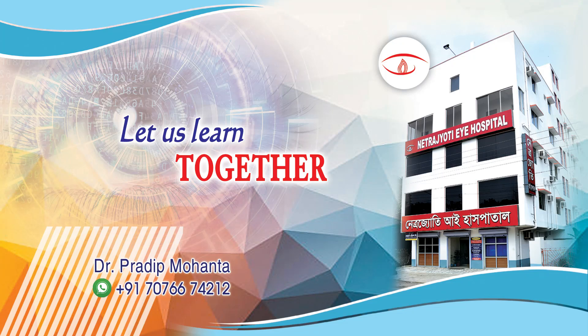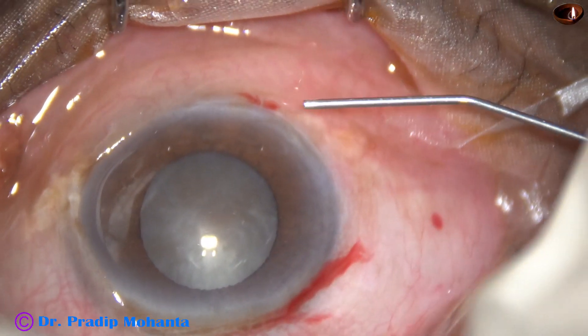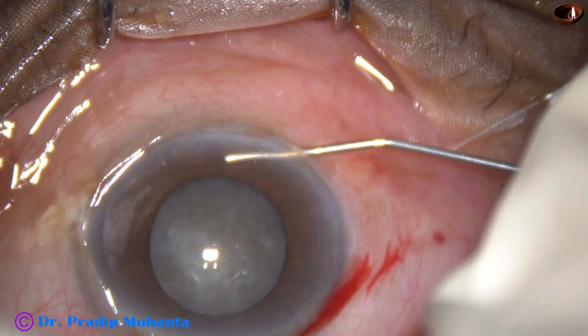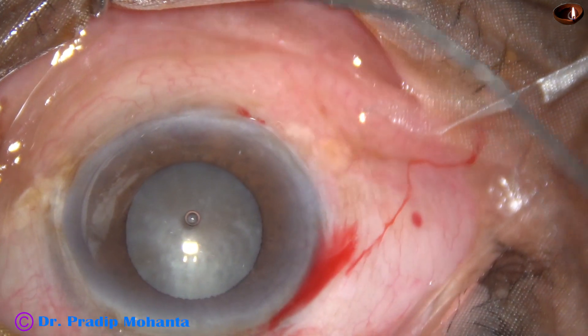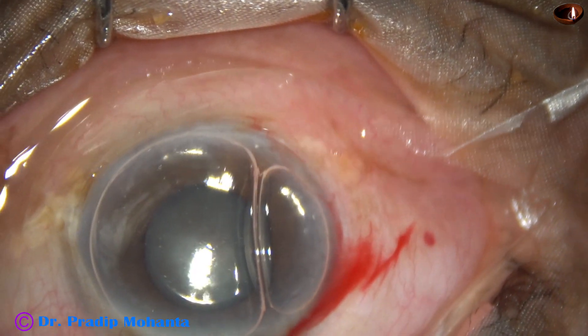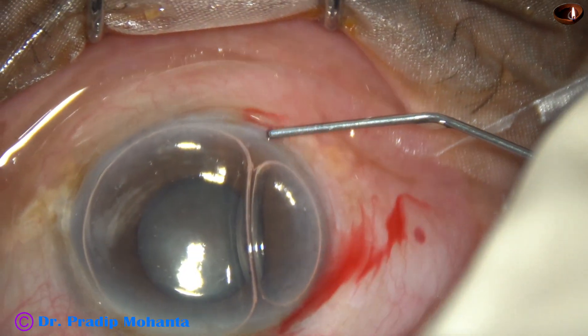Friends, welcome to my workplace at Ranagh Heart, West Bengal, India. This is a hard cataract with not so well dilated pupil; however, I could manage this case without using any pupil expansion device. Let us observe this surgery.